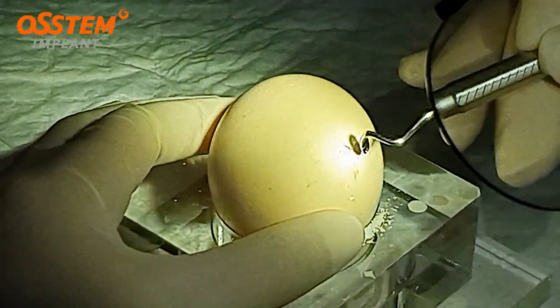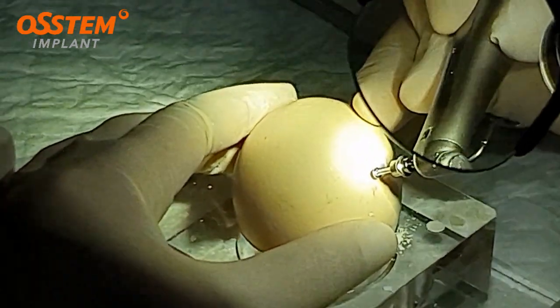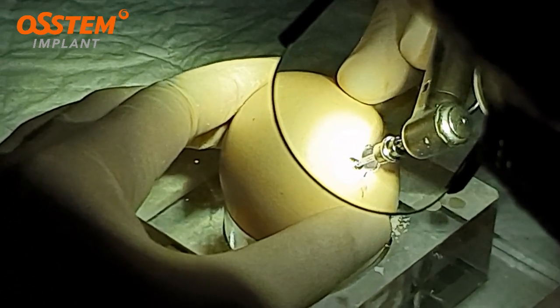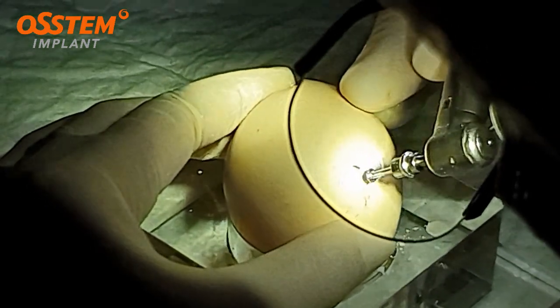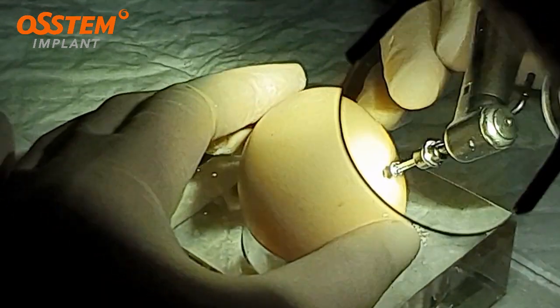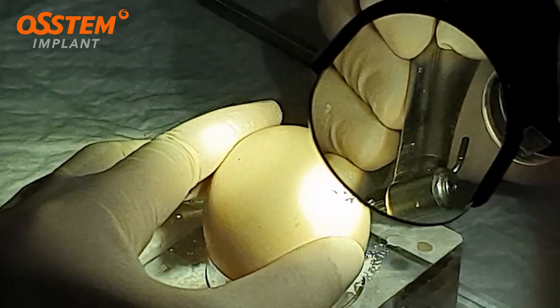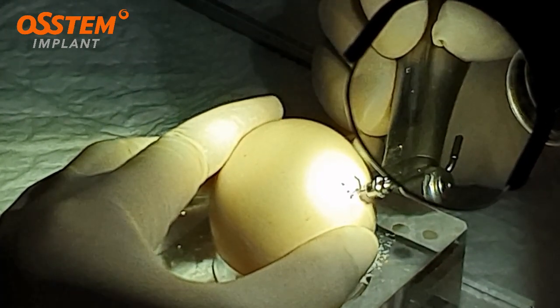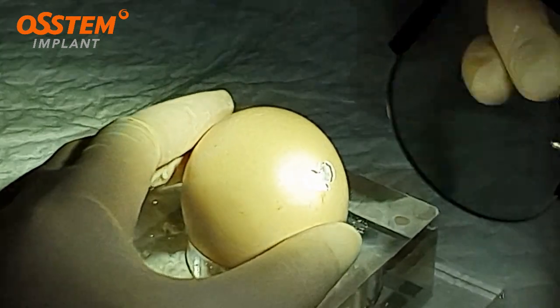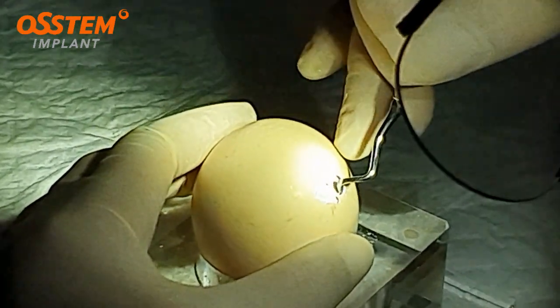Now you can see that I already removed the barrier in between the two circles, the two windows. I'm going to cut a little bit on the upper part here. If I want to extend the window slightly more, I can use the side cut to cut further and enlarge the window. I actually broke through slightly on the interior wall.